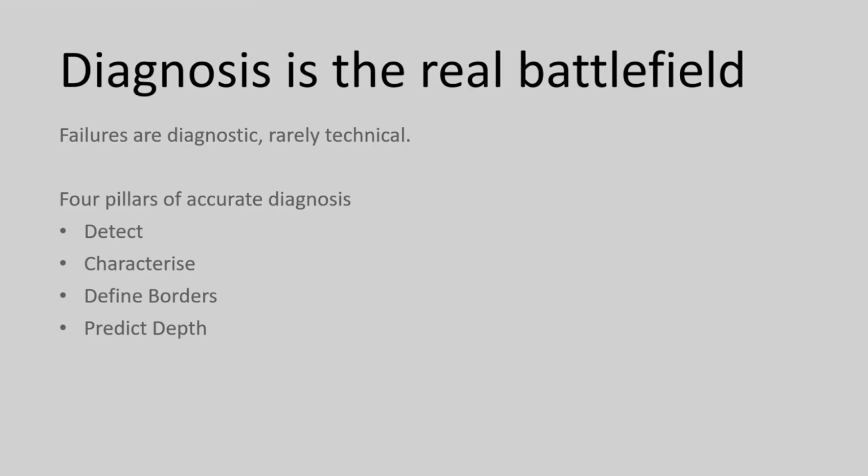We also are somewhat good at defining borders because of the various image enhancement modalities, and thanks to various companies, the innovations of NBI has changed the way we practice our assessments. These are inventions that we should be proud about. But what we are not so good at is characterizing and predicting the depth. With the help of AI, with CADx, we are getting there, I think. But we are not there in predicting the depth. I will tell you what I mean.